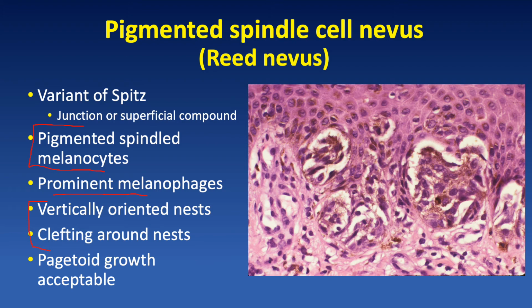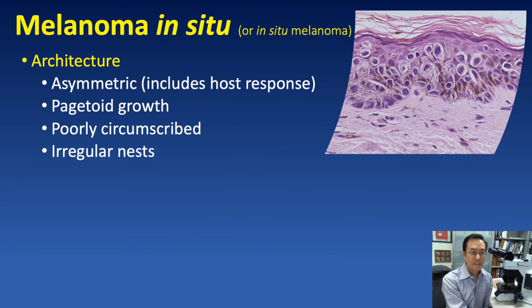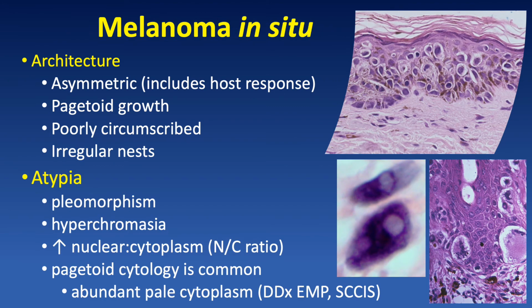not extending peripherally. So we finally made it past the nevi and some of the low-grade intermediate melanocytomas to melanoma, at least melanoma in situ. But we shouldn't be discouraged because much of the groundwork that we've laid in recognizing the histopathologic features of nevi can be contrasted with those of melanoma. So fundamental architectural and cytologic features in melanoma are often in direct opposition to those characteristic of nevi.